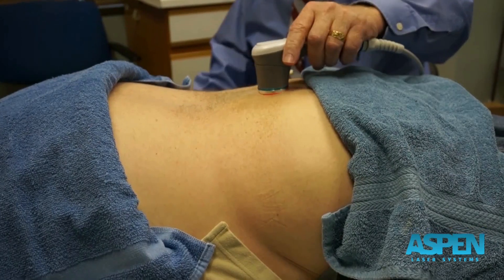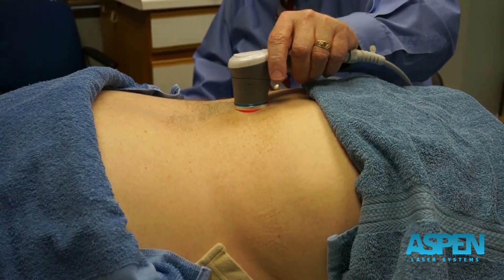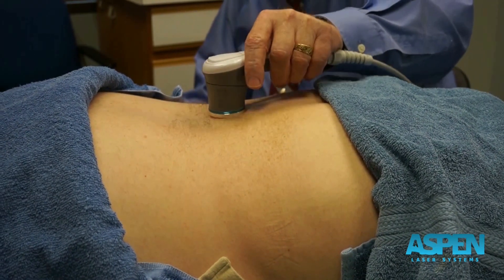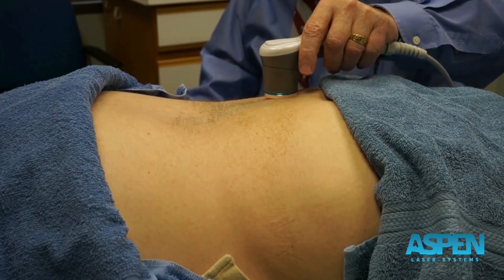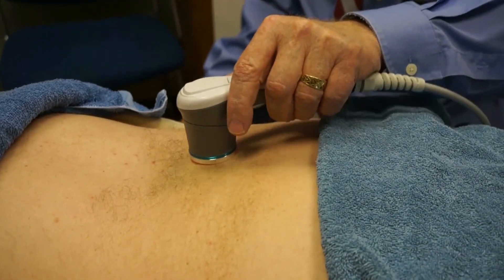So laser is on. I want to do this circular motion, just nice and slow throughout the area. I'm not particularly a big fan of doing strokes one way and strokes the other way — I get a nice lap-over effect doing this circular motion.